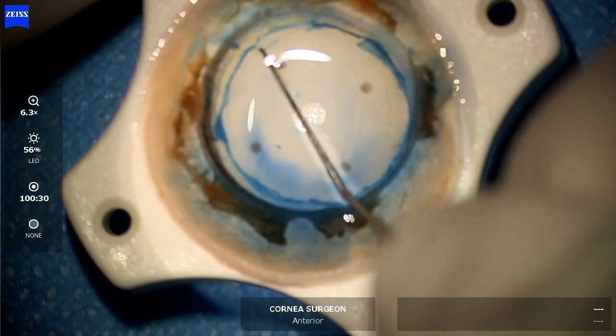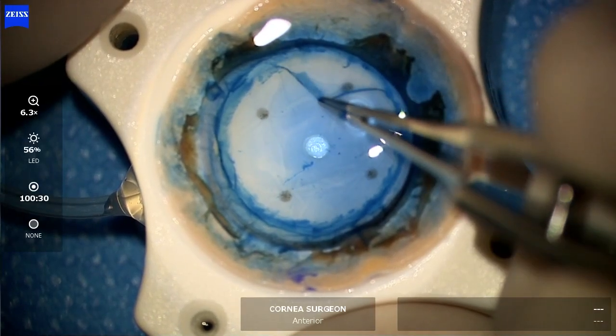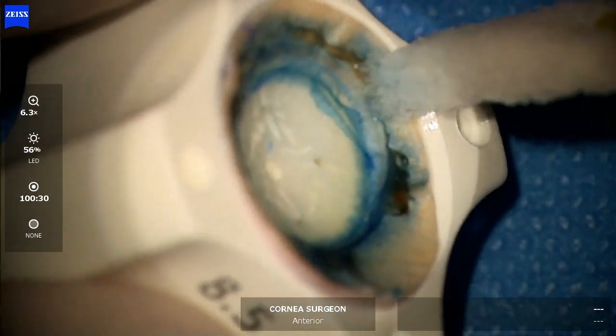The tissue is stained with vision blue, and a trephine is then used to punch out the desired size of the graft that's needed, followed by cutting with a 15 blade.